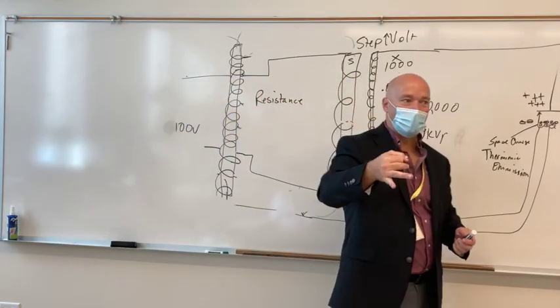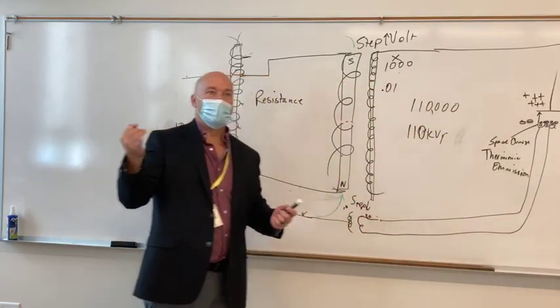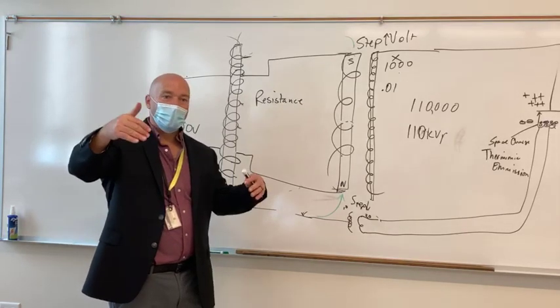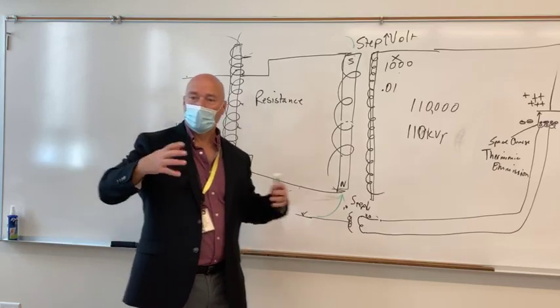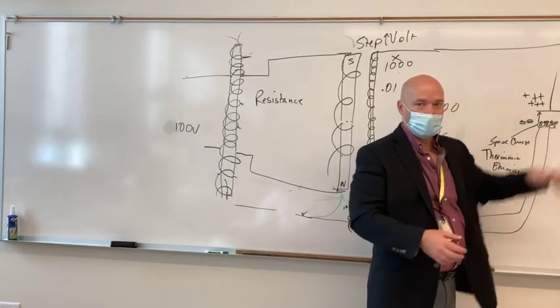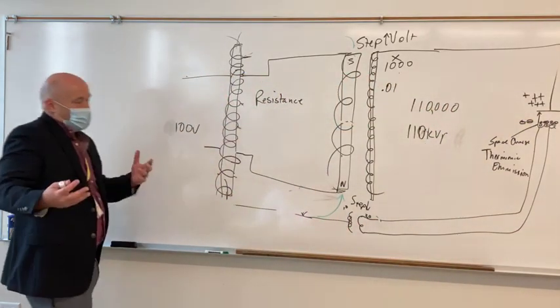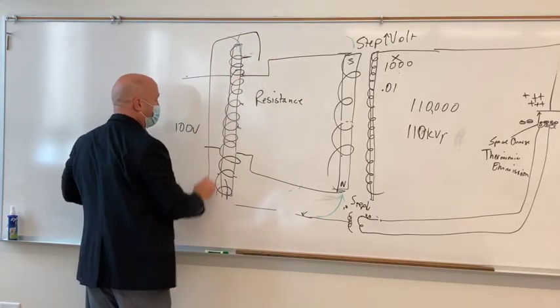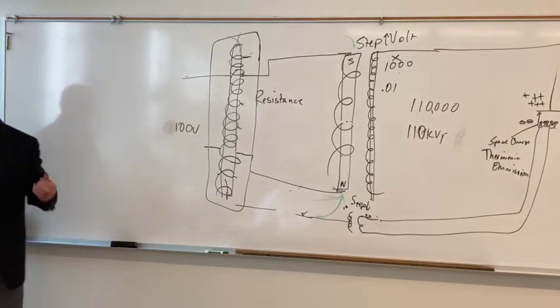Right, so we've got fan, oil, so we got, in those, we've got convection, convection's the fan. We got oil, which is conduction from the tube down into the oil, and then we've got thermal radiation from the anode and the cathode directly to the glass. So we've got three different ways to deal with it. We don't have all those to deal with here, but we can take these and put them in a great big box and fill them up with oil to try to keep them cool, and we do that.